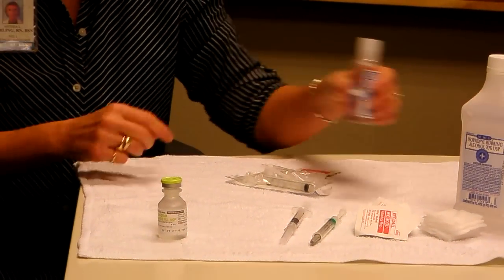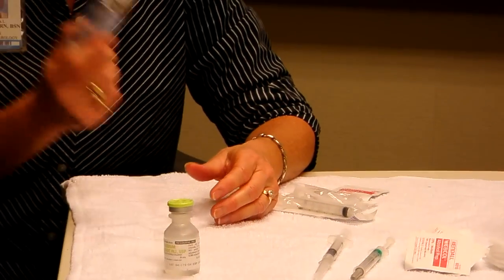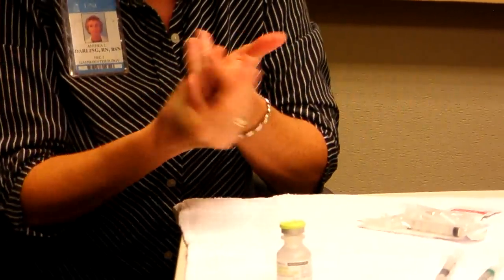You do need to make sure that you wash your hands when you're doing this. You want your nice clean hands. If you don't have access to a sink with soap and water, you can use a hand disinfectant to get everything cleaned up.